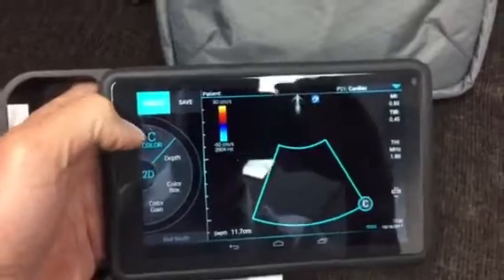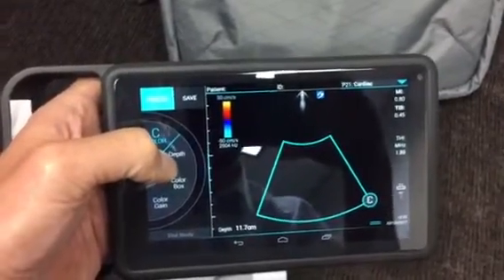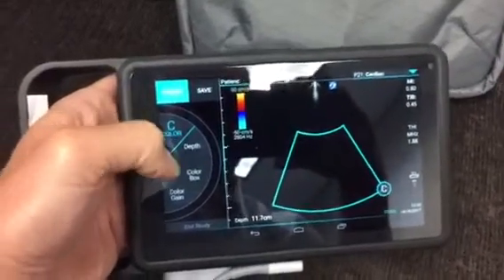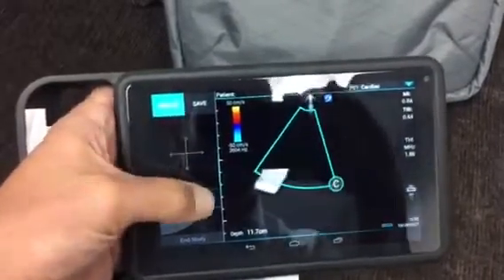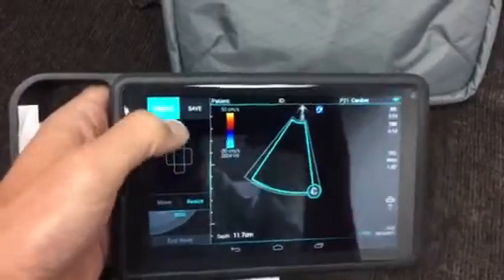The color feature on this is quite neat. The color box you can manually manipulate with your scanning hand, but easier still is to hit the color box button here and then use the controls to change the location of the box. You can also hit resize to change the size of the color box if you're using color.